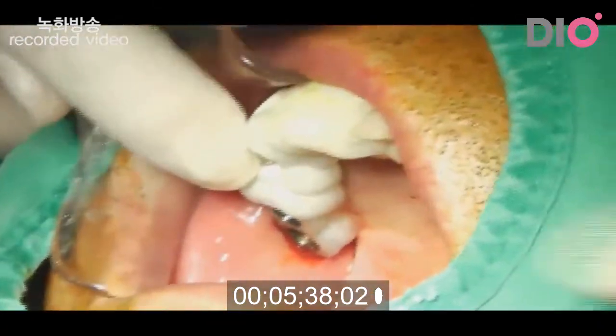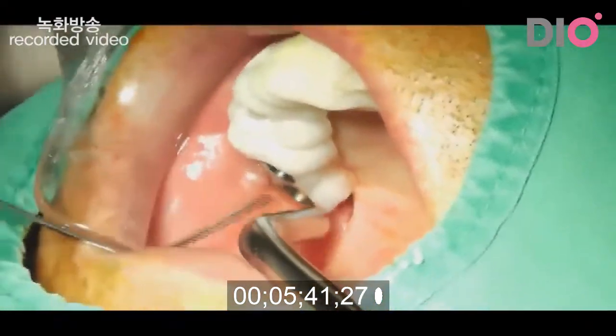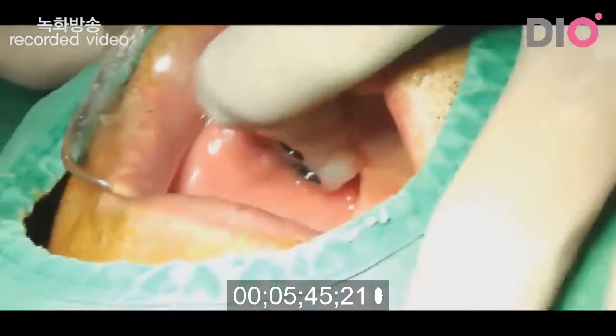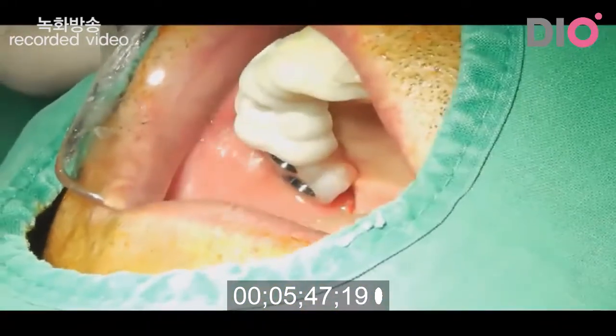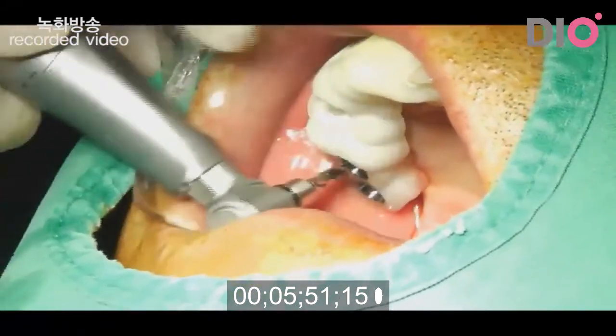I finished drilling in the second molar area using 2.7 drill. And then, 2.7 drill I will use in the first molar area.